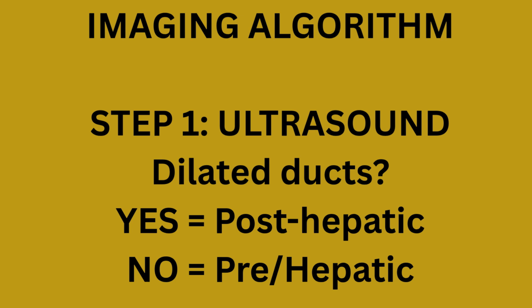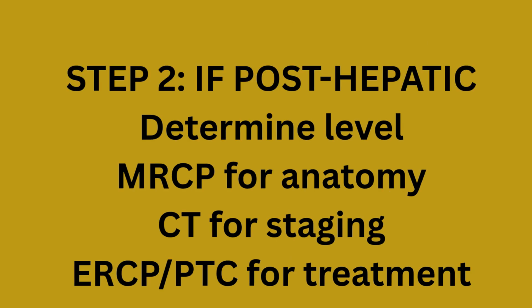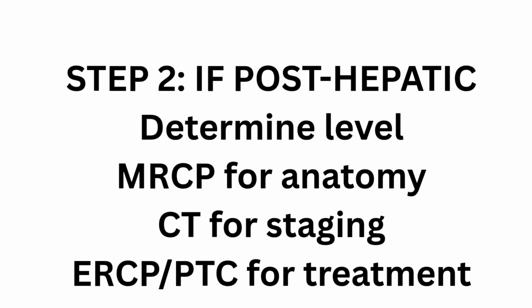Imaging algorithm. Simple and systematic. Step 1. Ultrasound always first. Are the ducts dilated? Yes means post-hepatic. Proceed to determine the level. MRCP for biliary anatomy, CT for staging, ERCP or PTC for therapeutic intervention. No dilatation means pre-hepatic or hepatic.